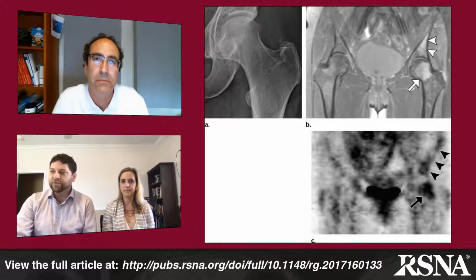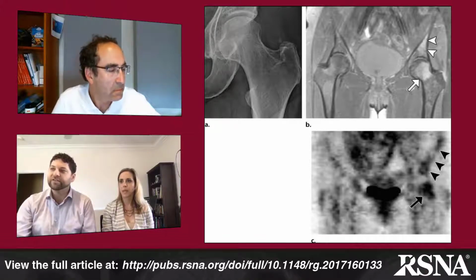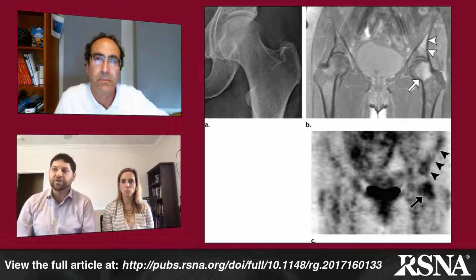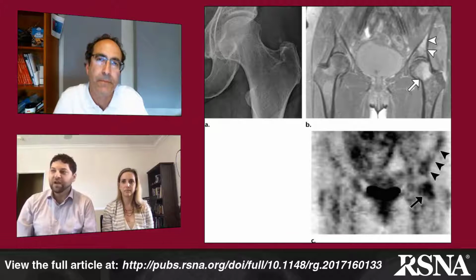So in Figure 2, we have a radiograph that is essentially normal. You can see the primary trabeculation pattern, including the compressive and tensile trabeculae of the femoral neck. The cortex appears preserved without endosteal scalloping. There's no periosteal reaction, although in the joints you wouldn't expect to have periosteal reaction because there's no periosteum.